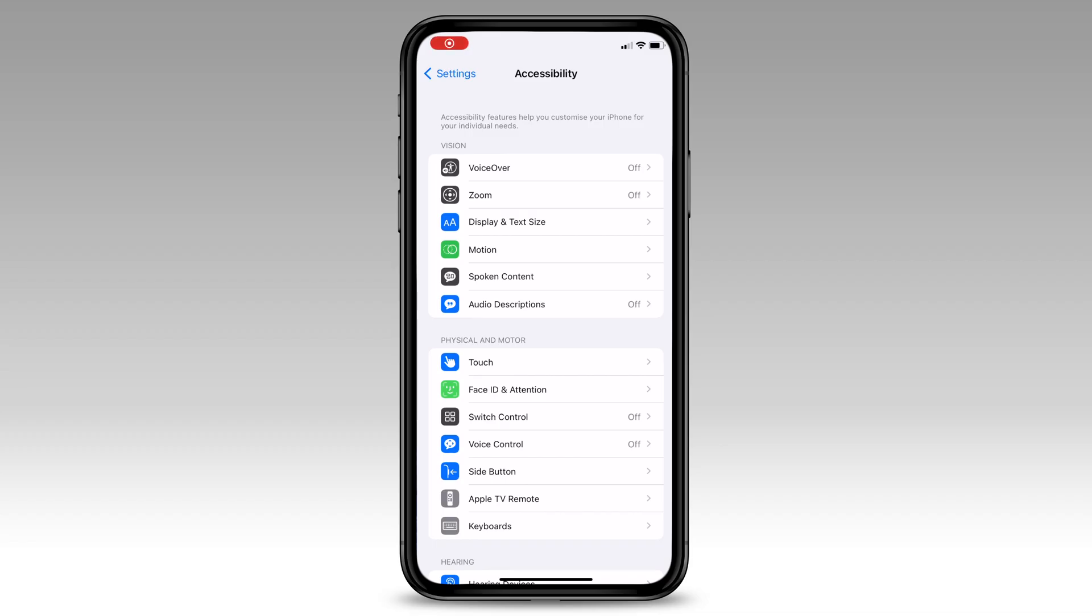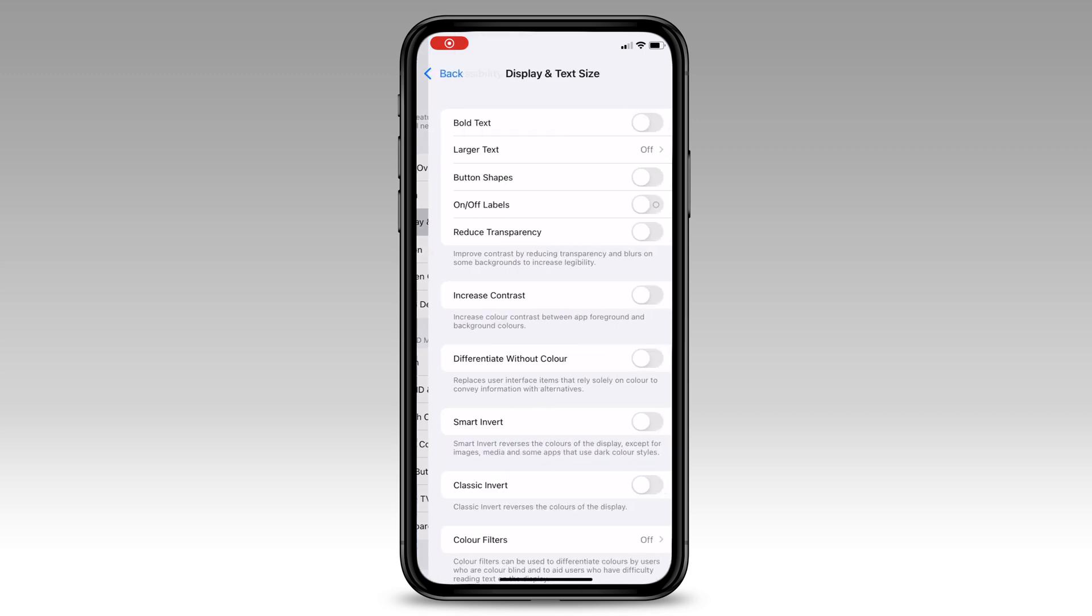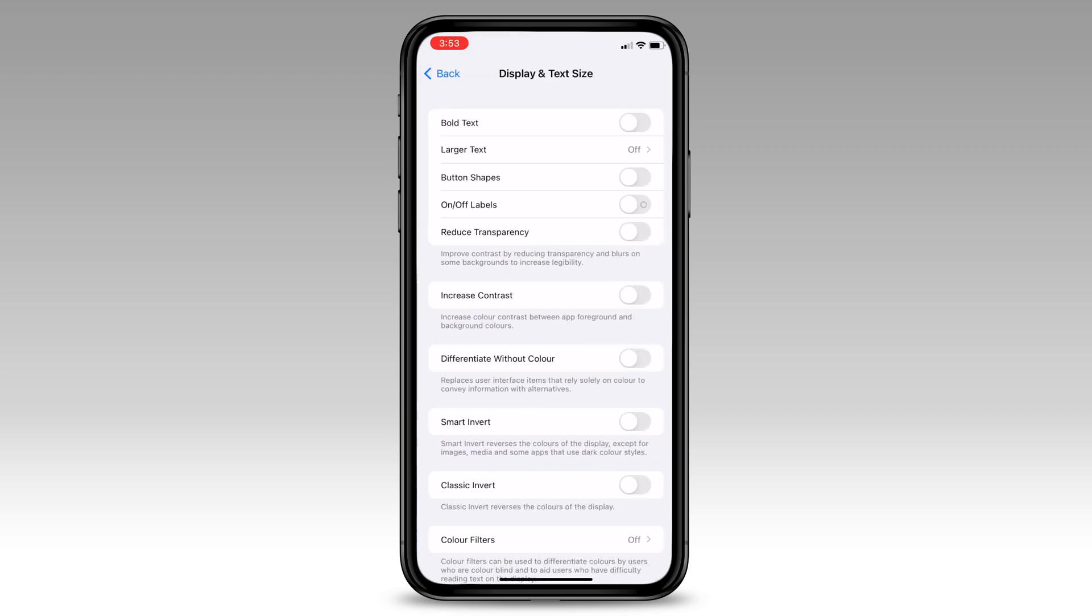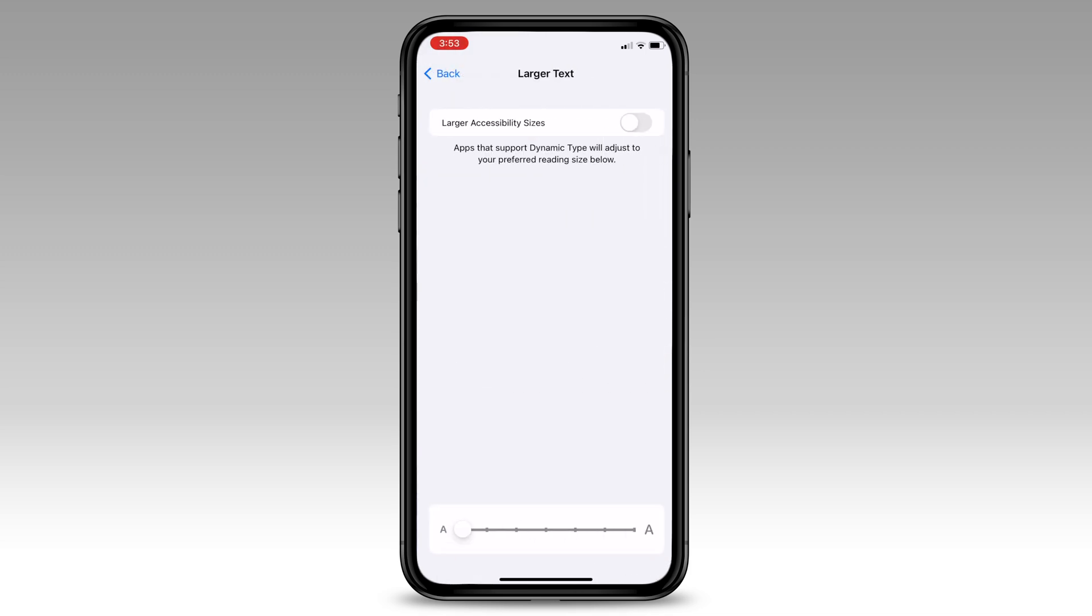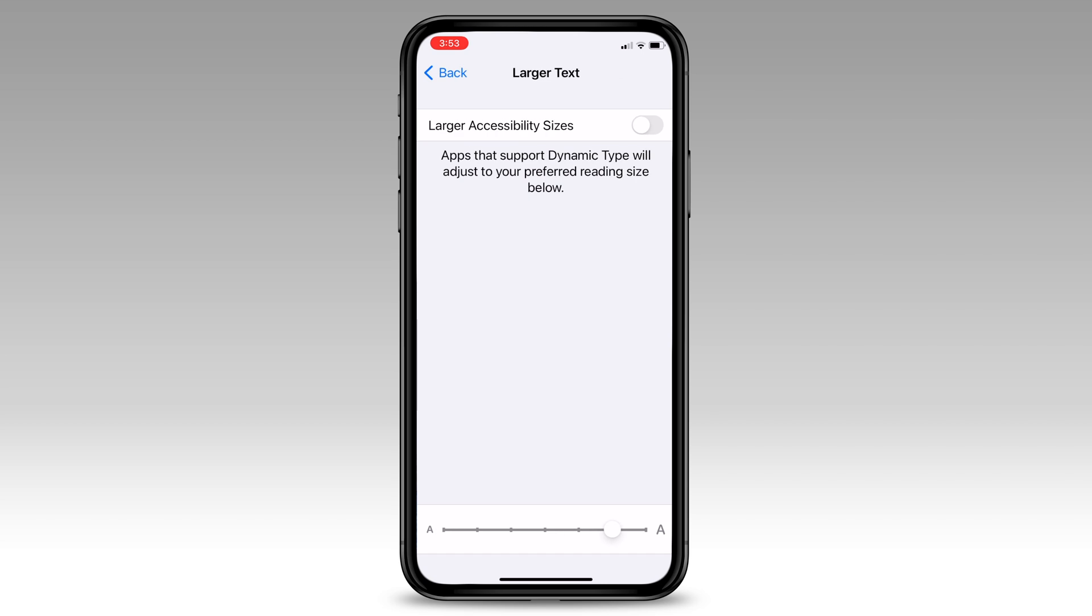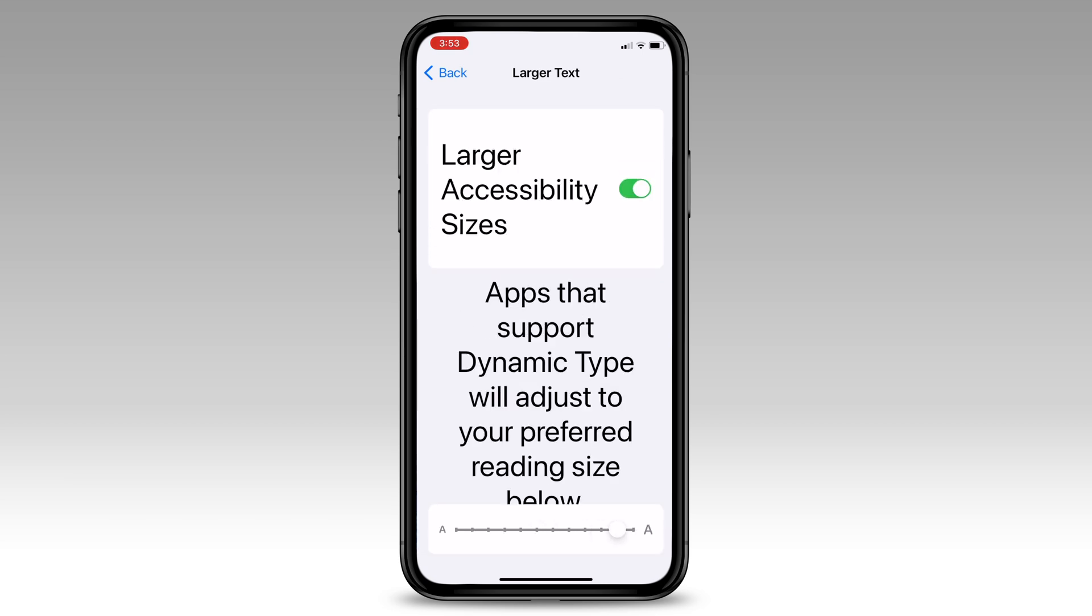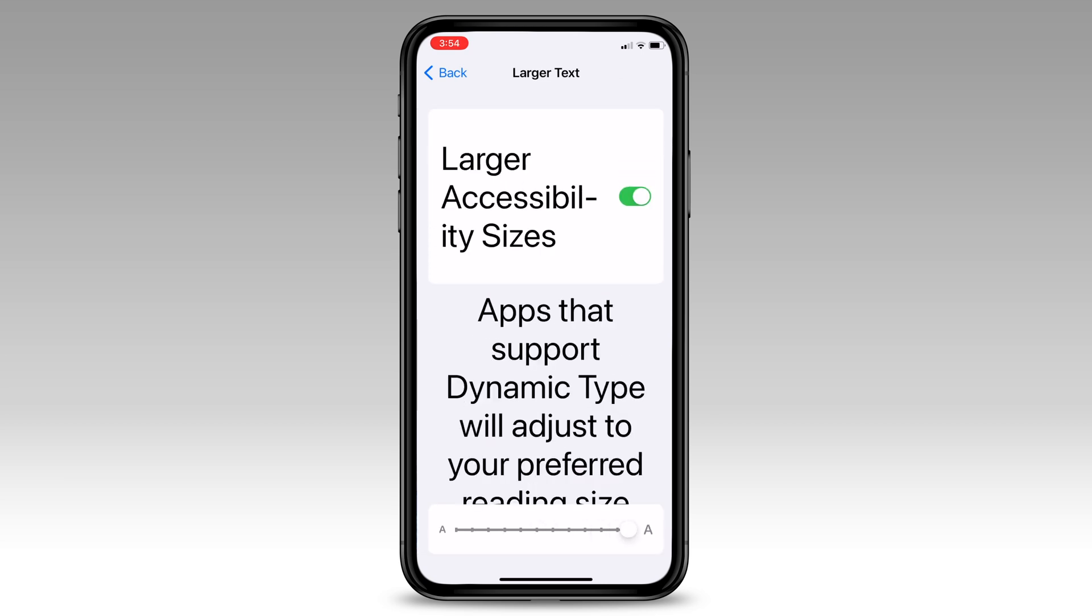We start off inside the accessibility settings, where we'll navigate to the display and text size setting. From here we have the option to increase our font size. This will make viewing text much easier across applications and the internet.